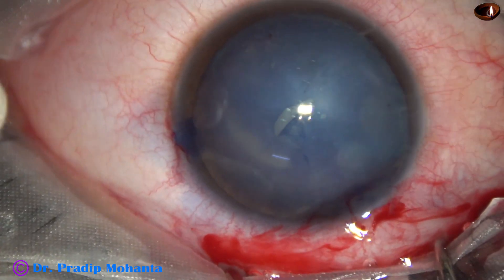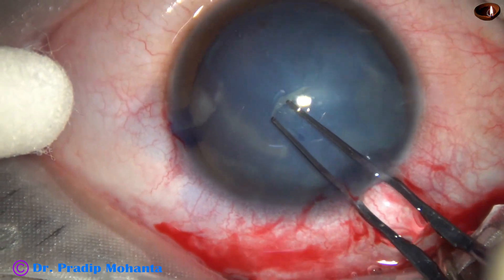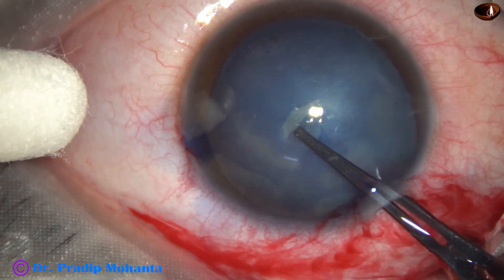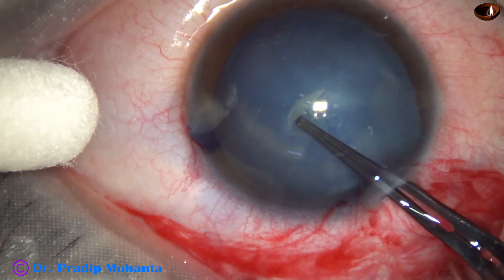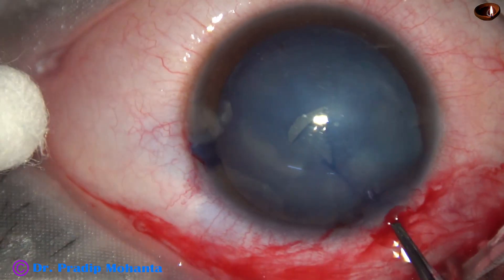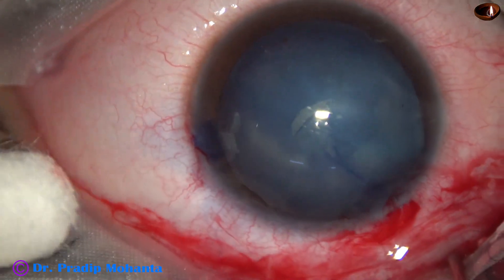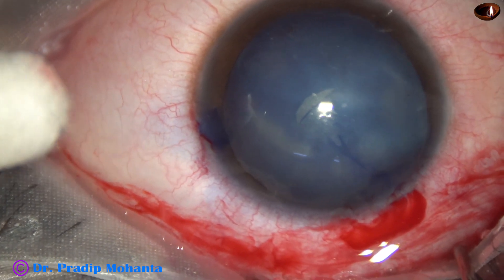He said that in such cases where there is a rupture of the posterior capsule in a young patient, we must not do hydrodissection. After capsular access, we will just aspirate the cortex with a Simcoe cannula or bimanual irrigation-aspiration. We will not do hydrodissection.